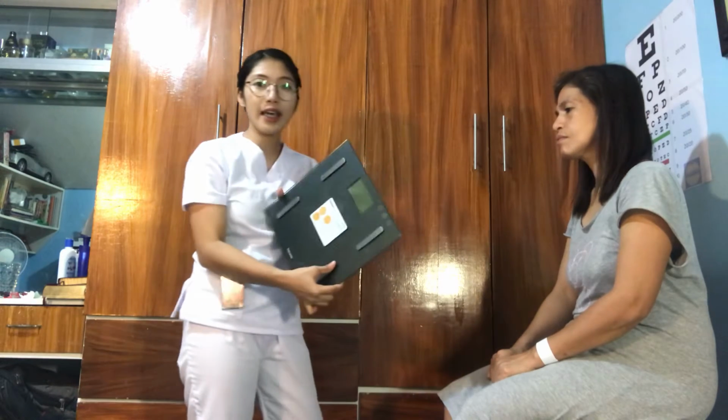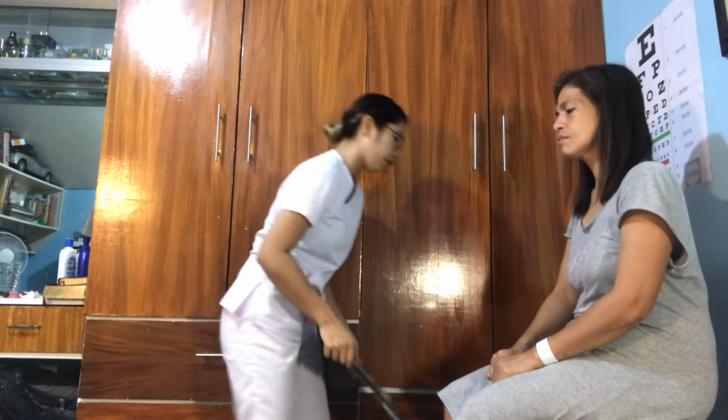And then of course, we also need a measuring tape for assessing the height of the patient since we don't have a stadiometer that could measure the height of the patient. Down here, we also have a weighing scale, a digital weighing scale, which could measure the weight of the patient.